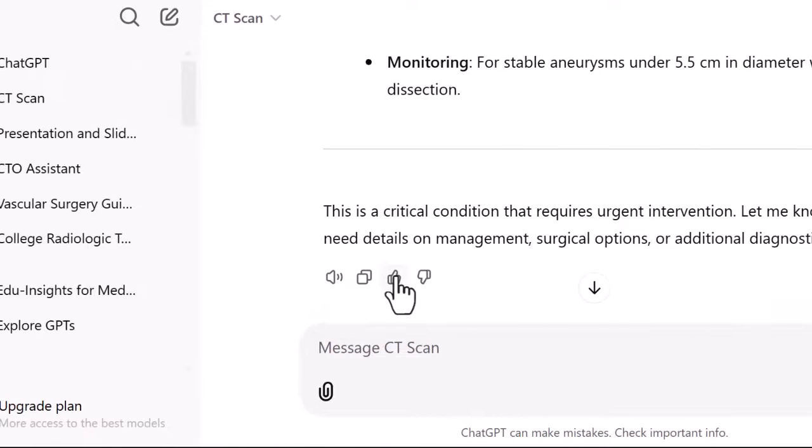And I would give it a 10 out of 10, really. This is a very, very great tool that you can use. It's free of charge. It would help you. Not only will it help you, but it will teach you as well how to read CT scan. And you can ask any question, as if you are speaking to a consultant radiologist. And I think it's a very, very useful tool to doctors, and I wish you all the best.